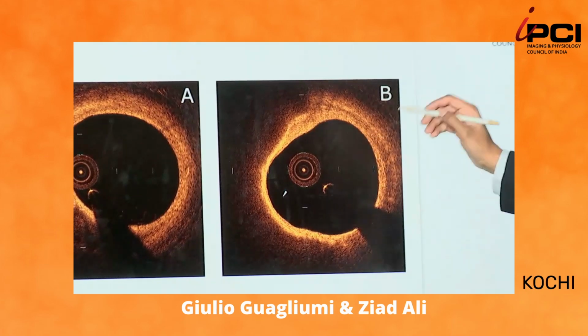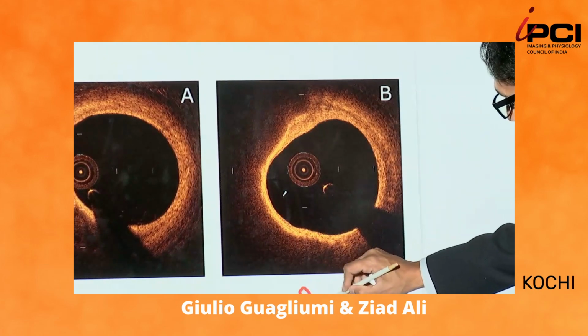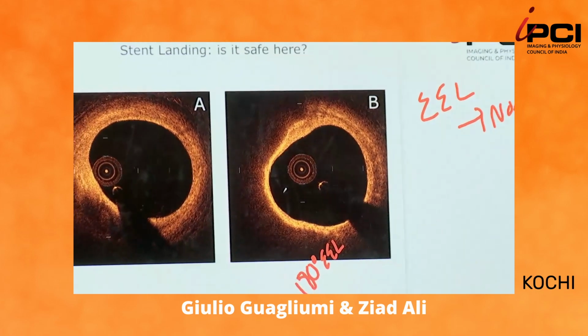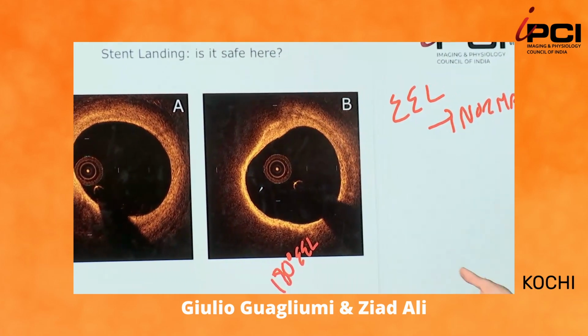Go ahead. So remember, one of our characteristics for stent sizing is we want to find 180 degrees of external elastic lamina. Why do we do that? It's only because the amount of visible EEL represents normal. You can only see the external elastic lamina in totally normal or fibrous tissue. And as Giulio mentioned, that's the perfect place to land your stent, either into normal or on a pillow.